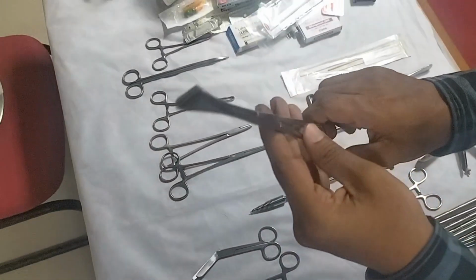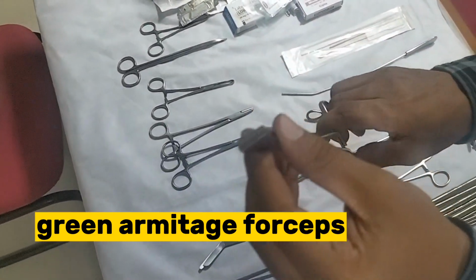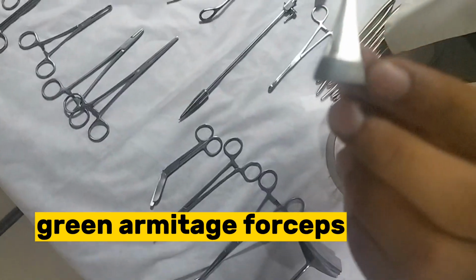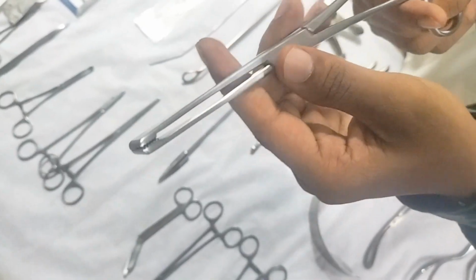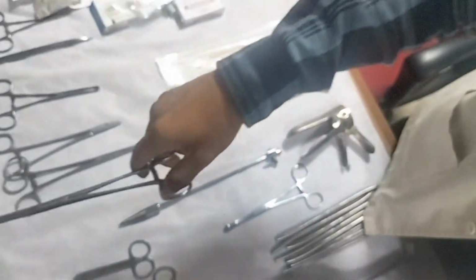Here we got Green Armytage forceps. In the proximal end we can see a ratchet lock mechanism and long shaft, and in the distal end you have longitudinal serrations on both ends. It is used for hemostasis of uterine vessels in case of cesarean sections, or to hold the uterine incision in case of cesarean section. There are two indications of Green Armytage forceps.